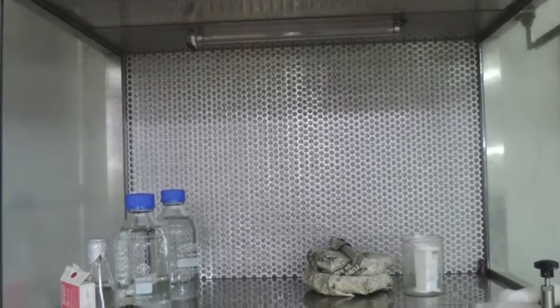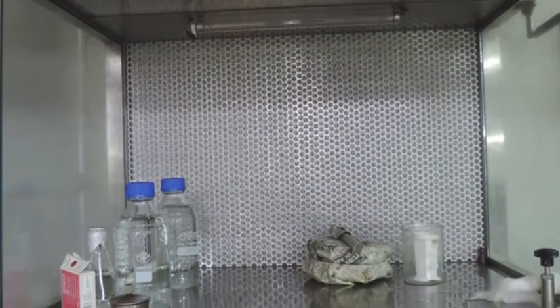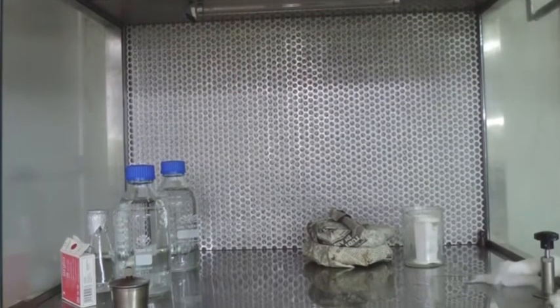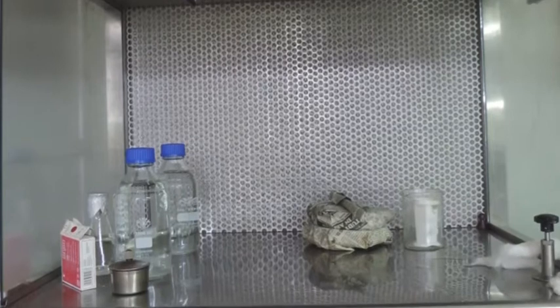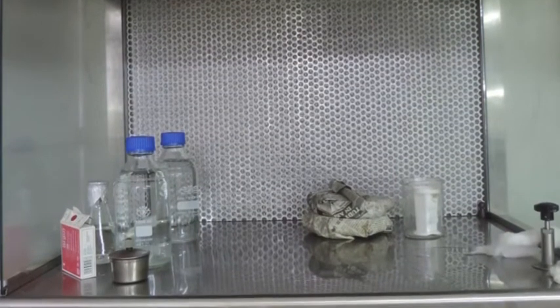Now spray the sterile workbench of the laminar flow with 70% ethanol and also spray vessels and all tool packets containing petri dishes, forceps, scalpel handle, razor blades etc. with 70% ethanol before placing them on the work surface.